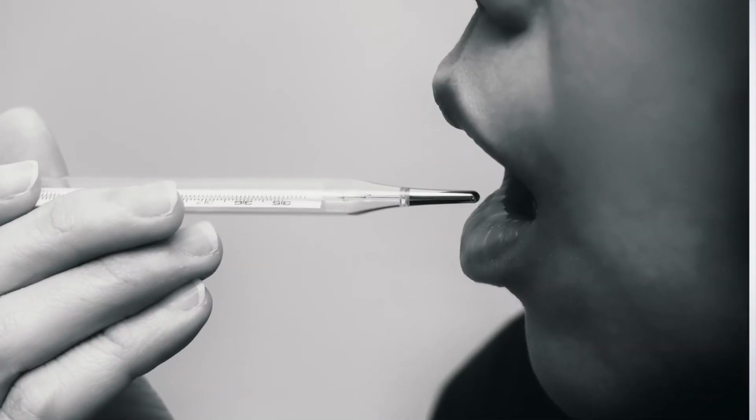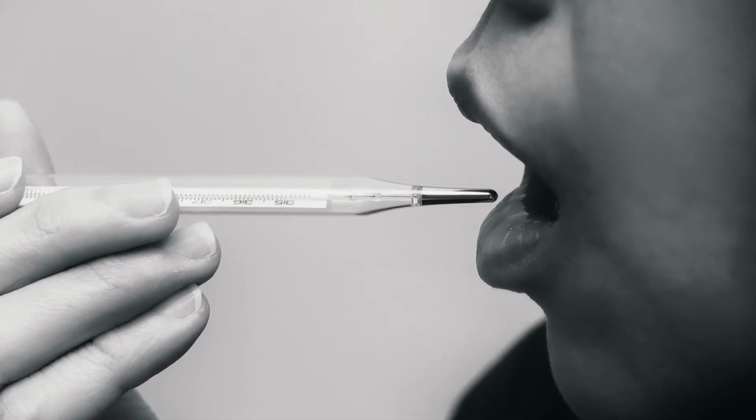So what is the second best site? The second site is the oral cavity. We all know oral cavity is the preferred site for adults because it is easily accessible and it gives reasonably good temperature. But there are also some problems here. That is, we cannot use the oral cavity for small children below 4 to 5 years. The number one reason is children will not be able to cooperate to keep the thermometer in the mouth for 2 to 3 minutes. And if at all, they may sometimes bite the thermometer and even end up in mercury poisoning. But for adults it's okay.